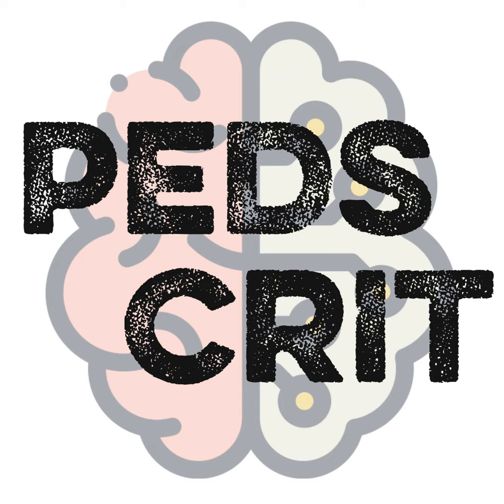So if you have somebody on conventional ventilation, your normal extubation setting is a PEEP of 5. Okay, and you have somebody with kyphoscoliosis or obesity, you just need to know that your extubation settings may be closer to a PEEP of 10 and be comfortable with that, rather than keep trying to get them to a PEEP of 5 and saying, I can't extubate you from a PEEP of 10. Instead you might say, for a sedated obese teenager, maybe I should extubate you from a PEEP of 10 and just put you on BiPAP and cut your sedation in half so that your own respiratory effort can re-recruit this, because I'm artifactually lowering your actual PEEP to a negative number if I were to try to get you to a PEEP of 5.